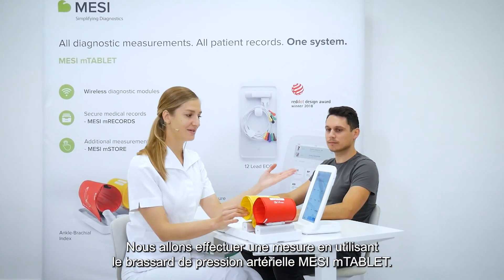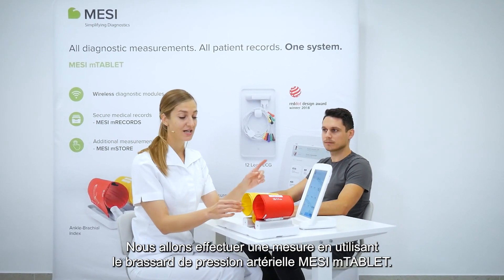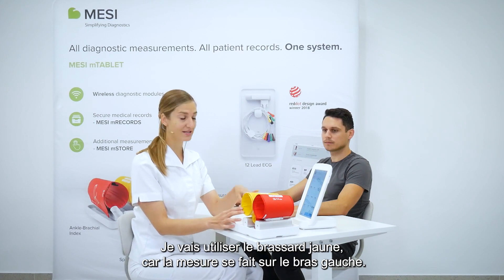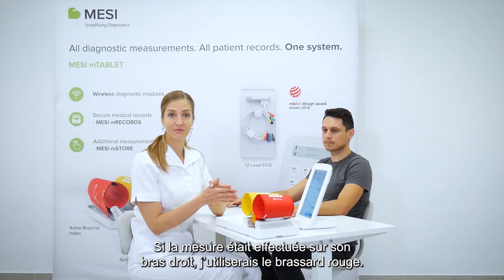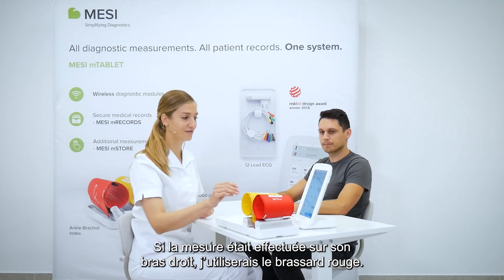We will be performing a measurement using the MESI mTABLET blood pressure cuff. Today I will be using the yellow cuff because I am performing the measurement on a patient's left arm. If I would be performing the measurement on his right arm, I would be using the red cuff.